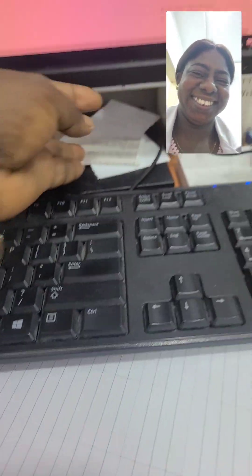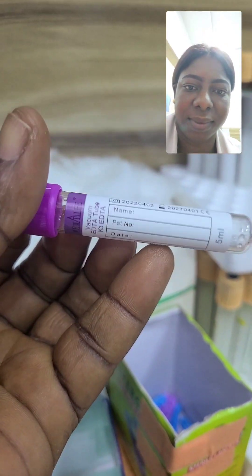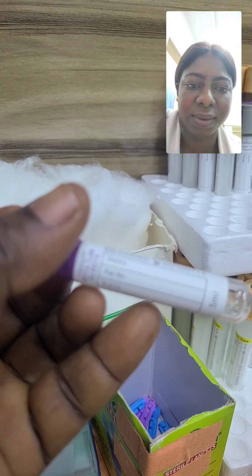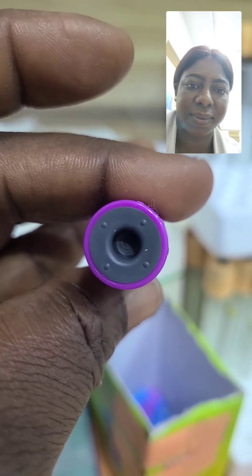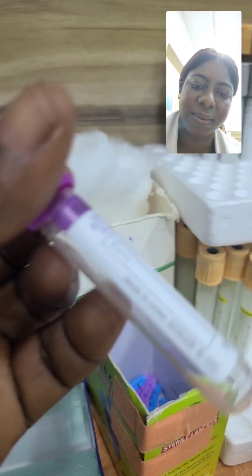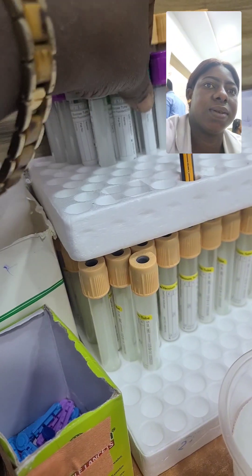Here are the bottles we use in the lab. This is the purple cup — the EDTA bottle. As you can see, we collect samples like full blood count and PCV, mostly hematology samples, to run hematology tests. We insert the butterfly needle through the bottle rubber so the blood flows directly into the bottle, and we label the container with the patient's details including the date.